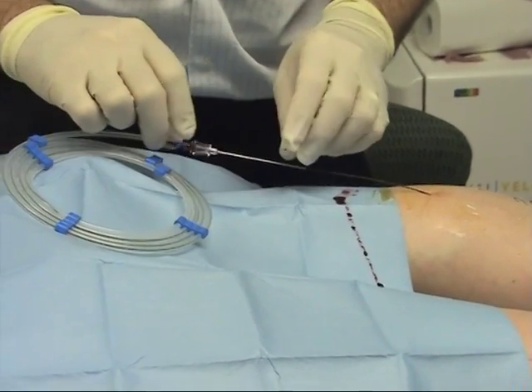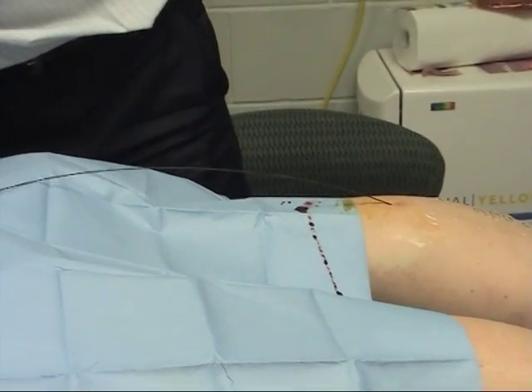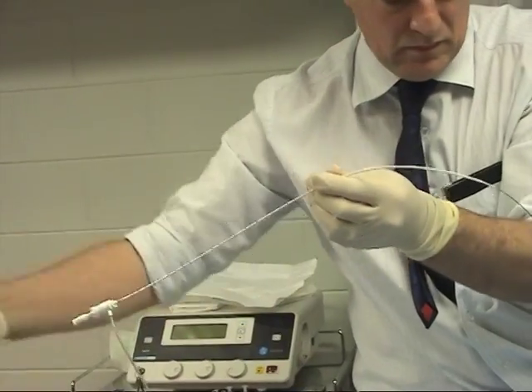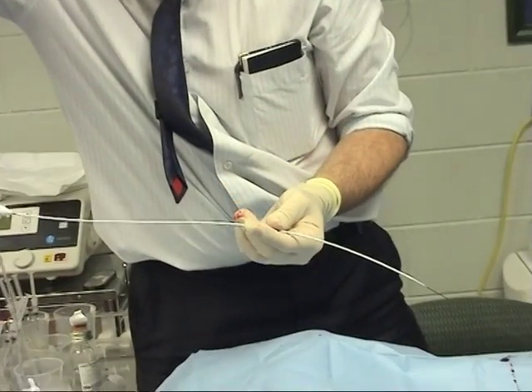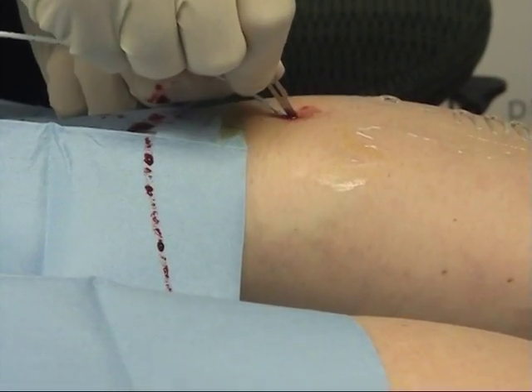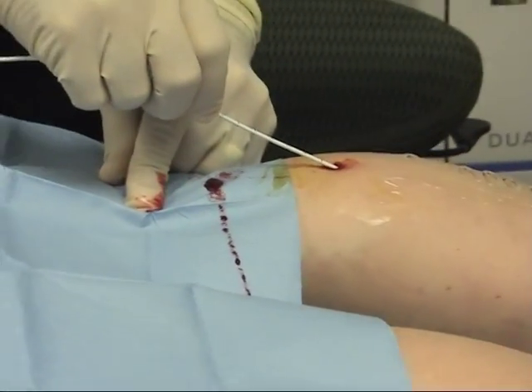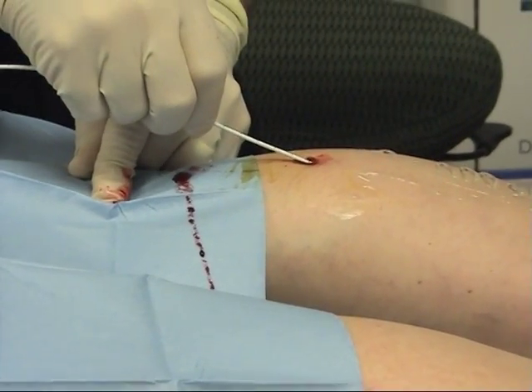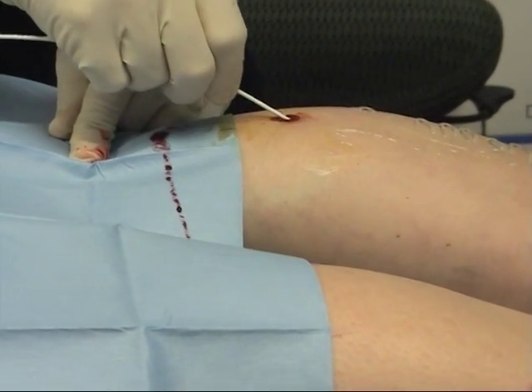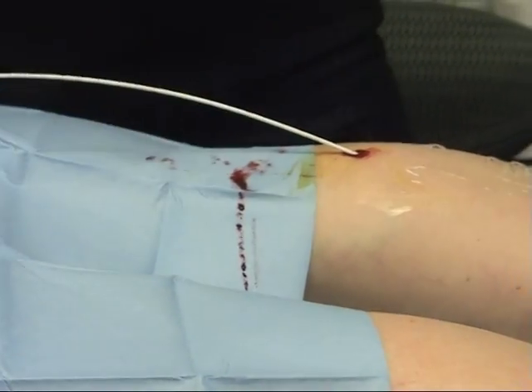Take that out and just slide that back — you shouldn't feel much with that at all. Then we end up with the guide wire. Through the catheter on the guide wire. I'm just going to make a bit more room for the catheter getting around that guide wire. You might just feel a little as it goes into the vein. That was a bit sore? A little bit. That's about the most you should feel from here on.